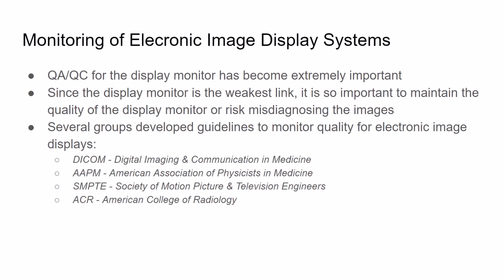developed guidelines to monitor the quality of electronic images on display, including DICOM, Digital Imaging and Communication in Medicine, the AAPM, or American Association of Physicists in Medicine. We follow these guidelines from this group since they perform testing on our equipment. SMPTE, the Society of Motion Picture and Television Engineers, and the ACR, American College of Radiology.